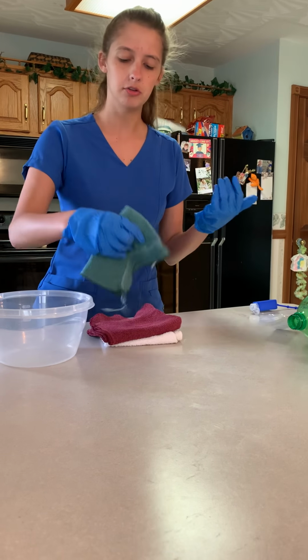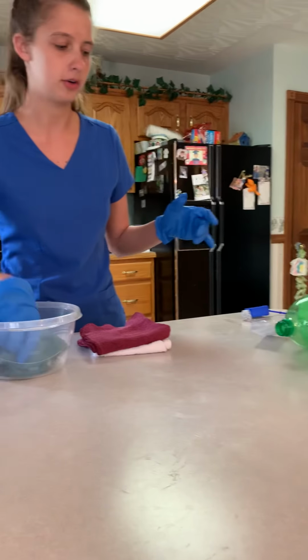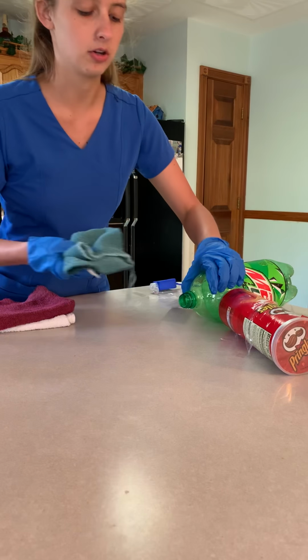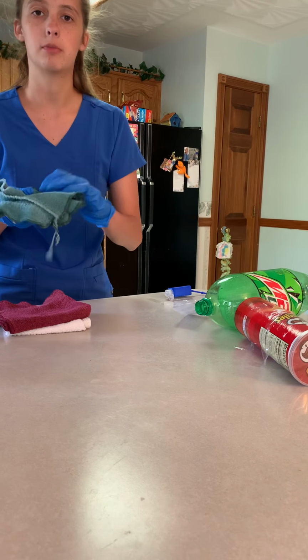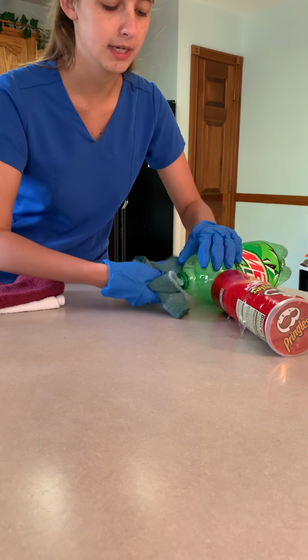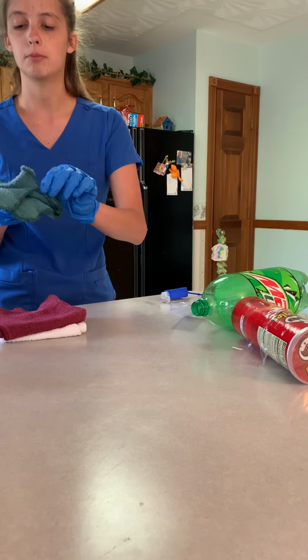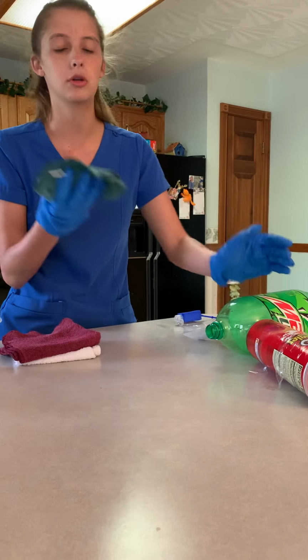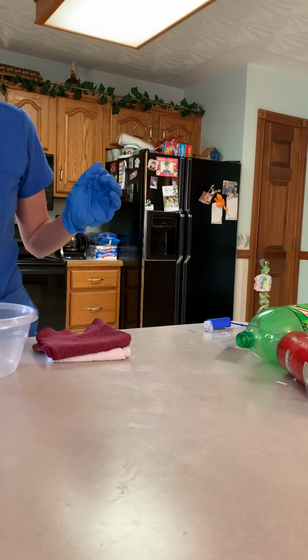Now I'm going to get my washcloth wet with warm water and soap, and we're going to clean around the head of the penis in a circular motion. We're going to use a different part of the washcloth to go around the shaft of the penis in a circular motion, and a different part of the washcloth to go up and around the scrotum in a circular motion.